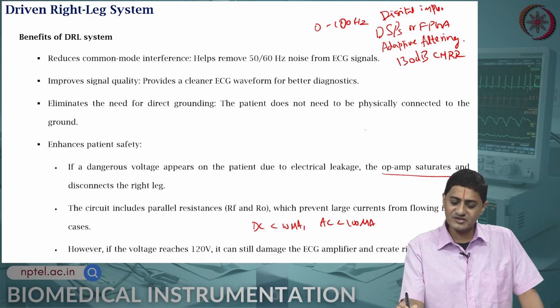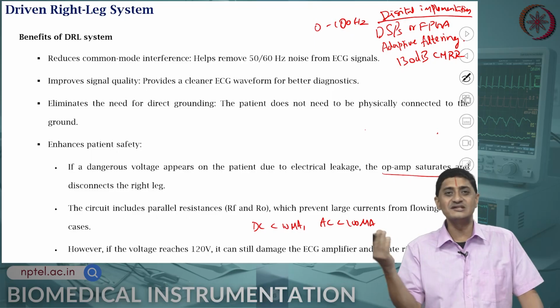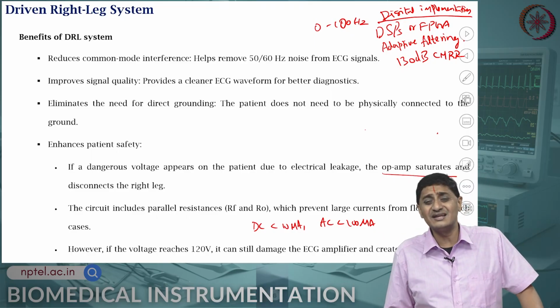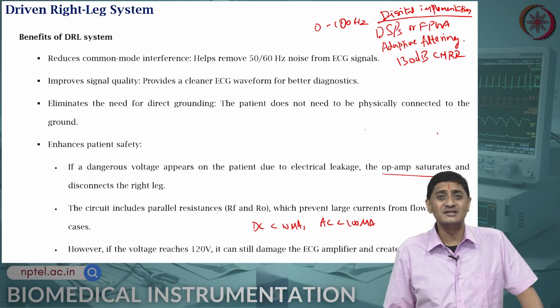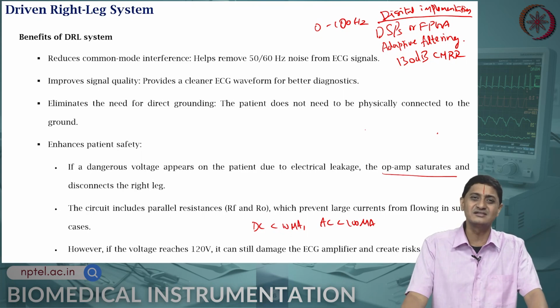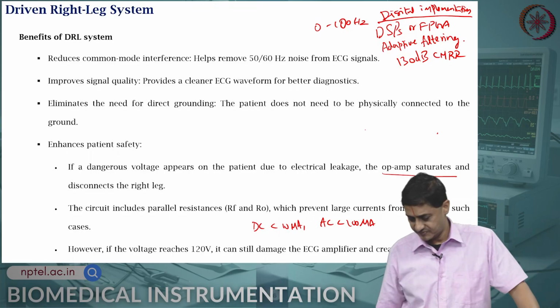Well, there is an advantage with the digital implementations. You might think, oh, digital is best, but then the disadvantage is that the lag or the delay in the digital implementation is in the order of milliseconds, whereas in the analog the lag or delay is in the order of microseconds. So, something to keep in mind. It is not that digital is always superior. Depending on the application, you might be interested in using analog sometimes more than digital. Okay.